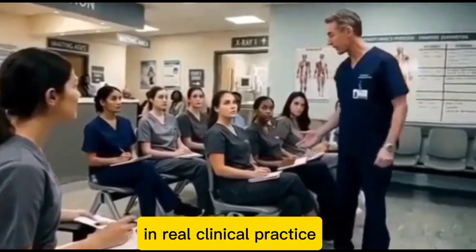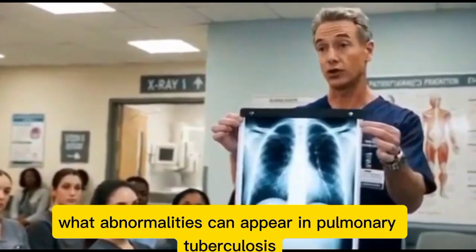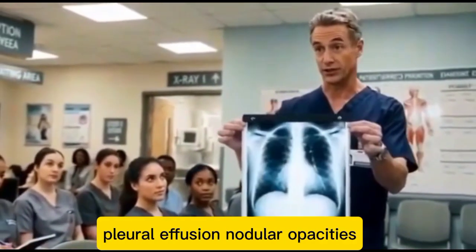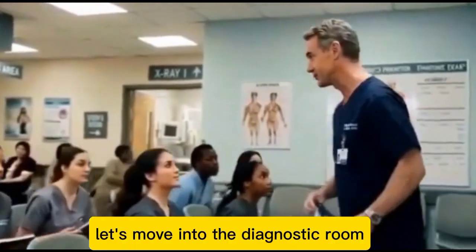In real clinical practice, radiographers must never focus only on the organ written on the request form. What abnormalities can appear in pulmonary tuberculosis? Upper lobe infiltrates. Cavitary lesions? Fibrosis. Good. We may also observe consolidation, pleural effusion, nodular opacities. So chest x-ray helps evaluate disease activity? Yes. Enough theory. Let's move into the diagnostic room.